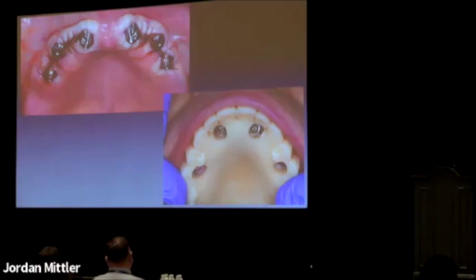And in fact, in this case, what happened was I was a little off in the anterior and I had to use my angled abutments in the anterior. So I actually did not attach the 2 lateral incisors at this point. But again, all on 4 is enough. It is adequate, but I eventually will get this to all on 6, make our holes in our denture, attach it, trim the flanges, cut out the palate.